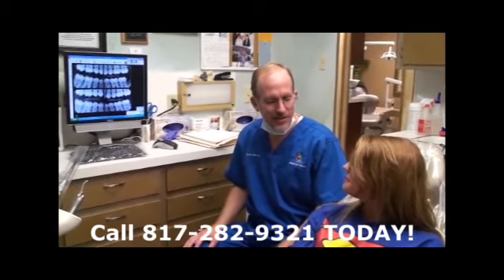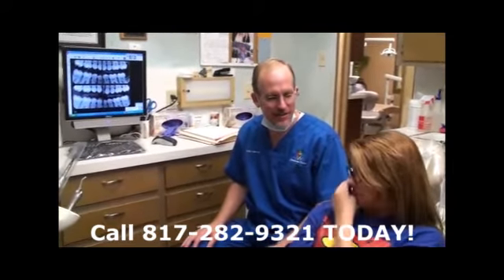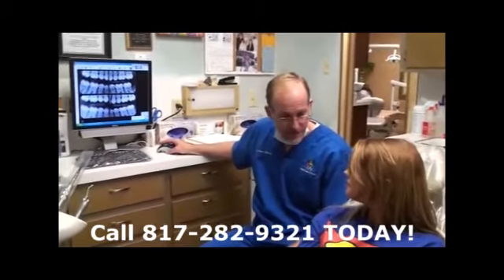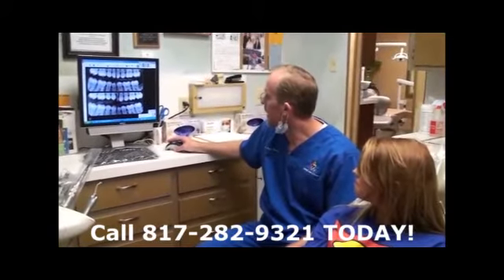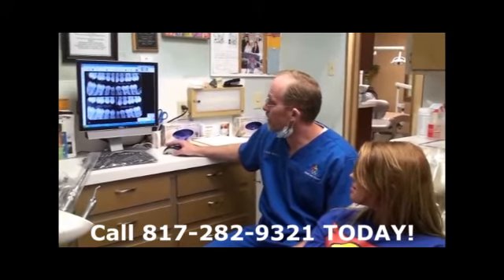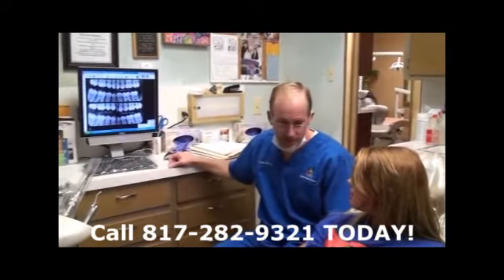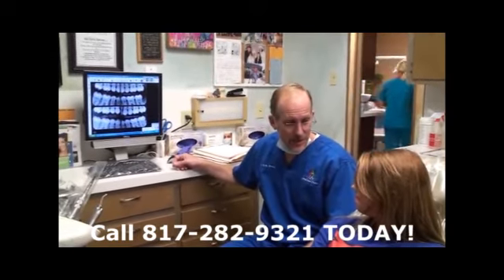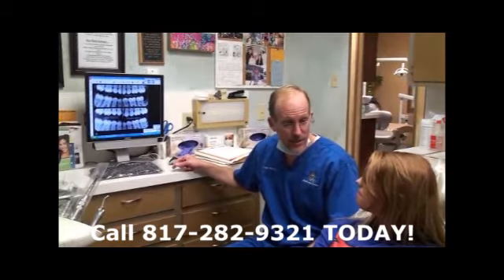Hello, Miss Lauren. How are you? Good. I'm Dr. Eberlein. We're here to take good care of you today. Now we got some digital x-rays of your back teeth. And what we want to do is look at your x-rays here and see if there are any indications that you may have cavities starting in between your teeth.